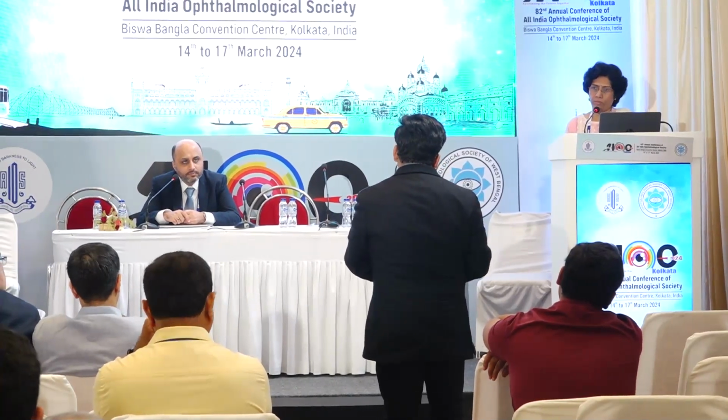So for combined retinal detachment, one thing Dr. Dhanashree has highlighted is to remove the membranes to the maximum. If there is a break, you can't leave the membranes. In normal TRDs, you may still leave some areas of traction on the nasal side, which is not affecting the macula, but for combined, it is not. You have to remove all the traction which is there. Second, in combined retinal detachments, as she mentioned, the subretinal fluid is very thick. And so you do a fluid-fluid exchange before you start attempting the fluid-air exchange to completely flatten the retina. I think this is another point I'd like to make.